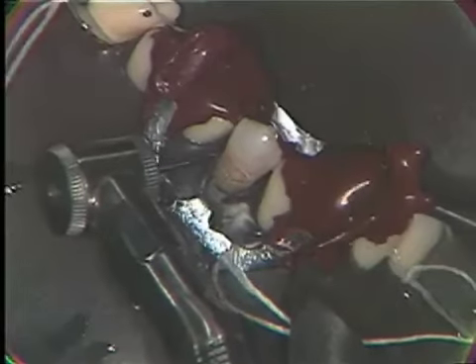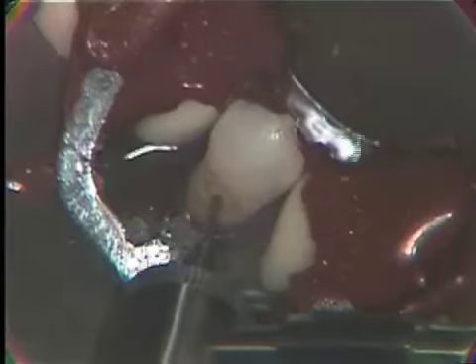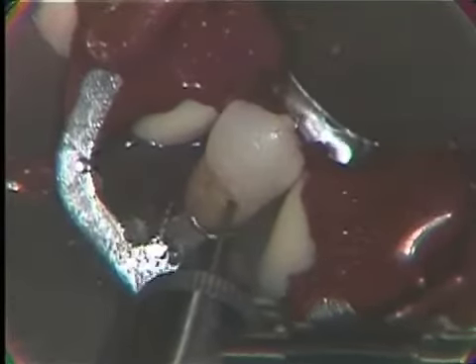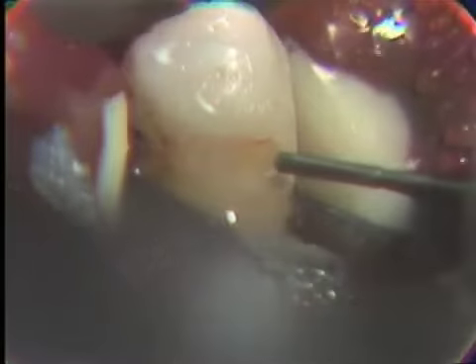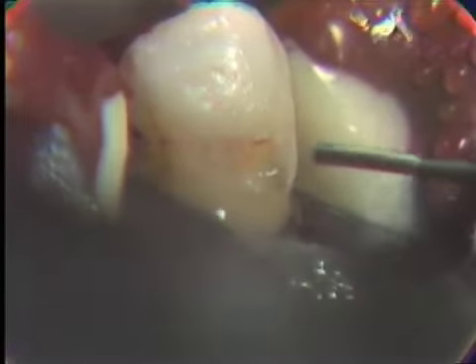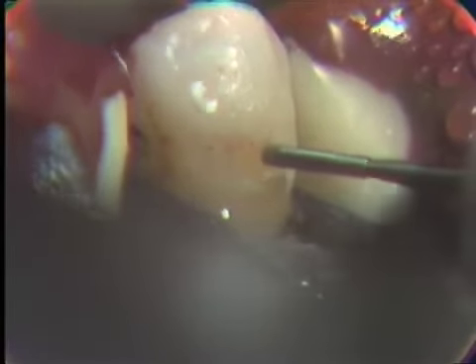The curvature that we're establishing is compared to the cavo surface curvature of the tooth, and it therefore is in the same curvature of the pulp chamber. So using our 55 bur, we will begin to establish our final outline form. Now these burs cut very rapidly, and you must use a gentle stroking motion as you extend to the mesial and to the distal.